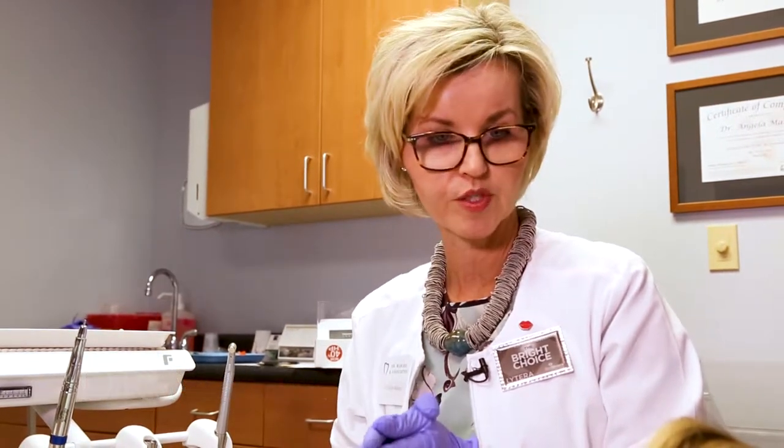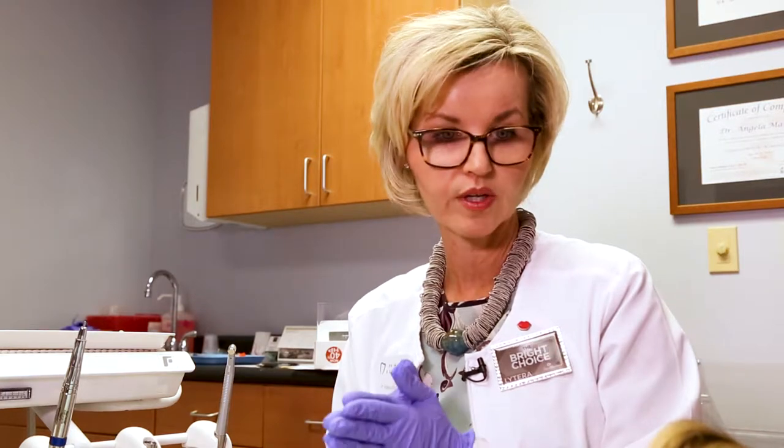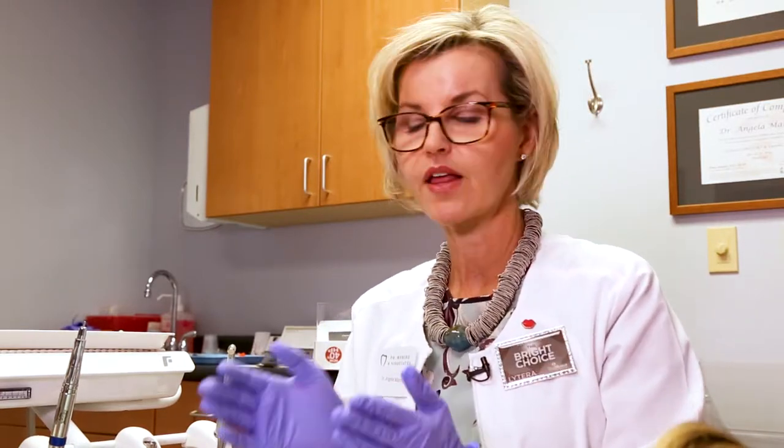You expressed an interest in bleaching your teeth. Today we're going to use an in-office bleaching system called Opal Essence Boost. The nice part about this procedure is it takes less than 30 minutes. The level of whitening that you'll get is the same as using at-home trays for 14 days — so basically 30 minutes versus 14 days.